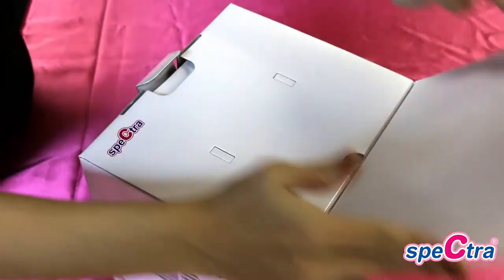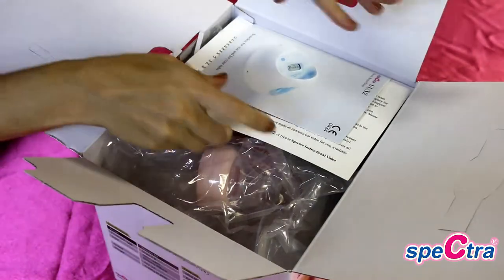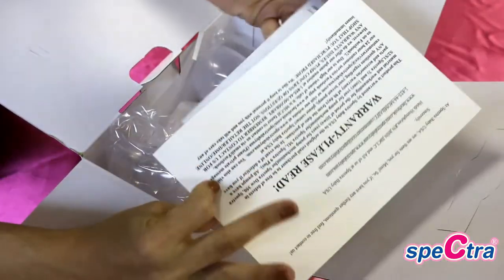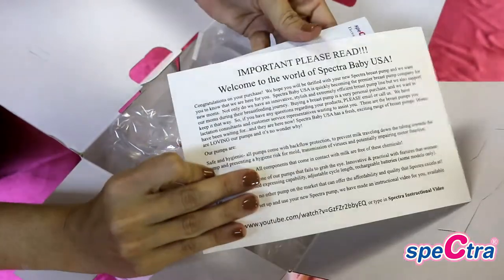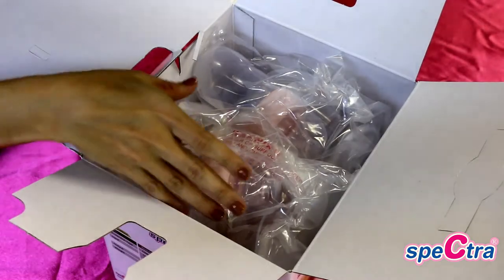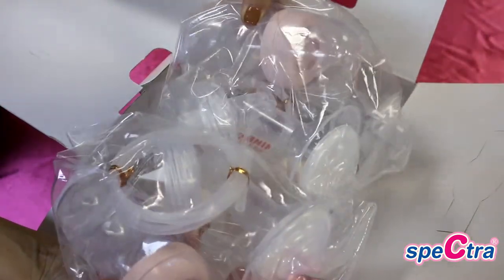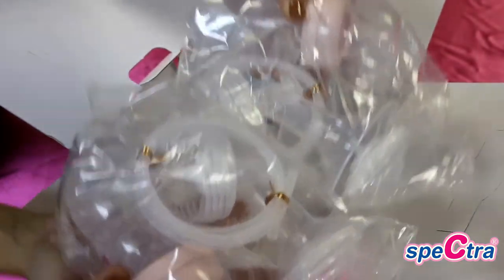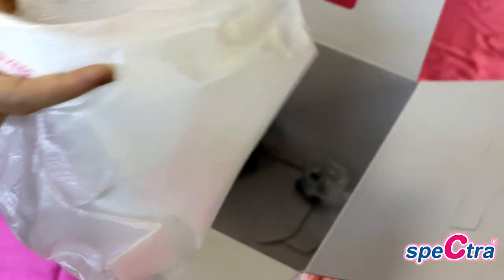When you first get your Spectra pump, you will start by opening up your box. On top you will find your instruction manual as well as your warranty card, in case you need to submit a warranty claim. Next you will find your two double collection kits with everything you need to double pump.